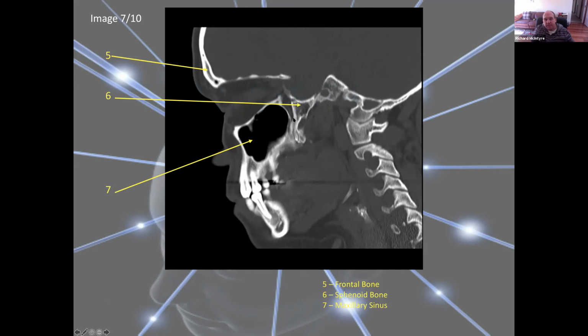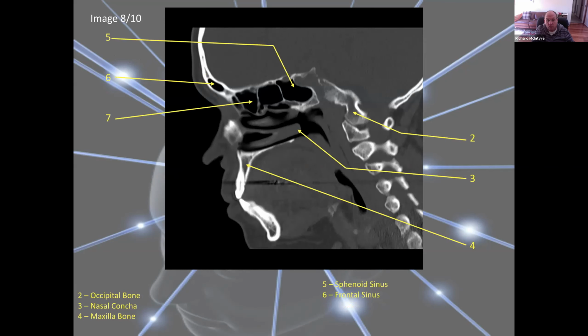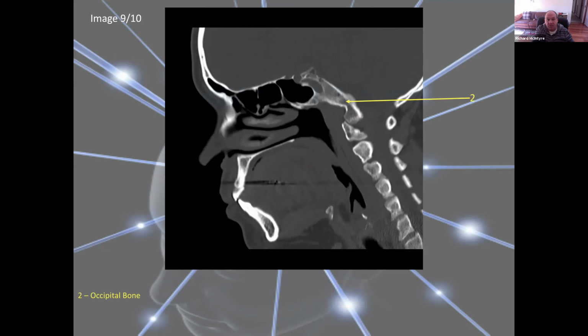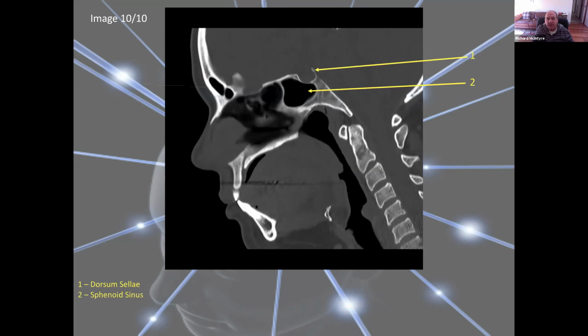The clivus, okay, the sphenoid bone. I just, again, I'm getting tired. The sphenoid bone, okay, and the clivus is here. Okay, so I don't think this is the clivus here. All right. And then, of course, we see the structures more in the midline. So there's the clivus.